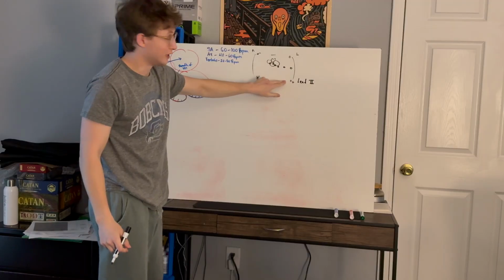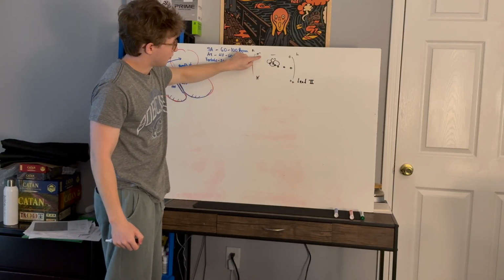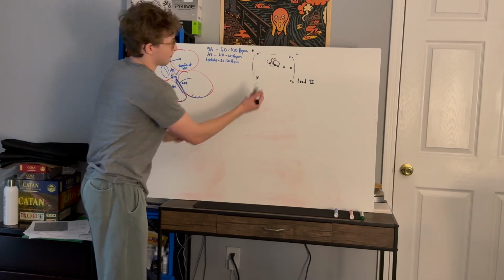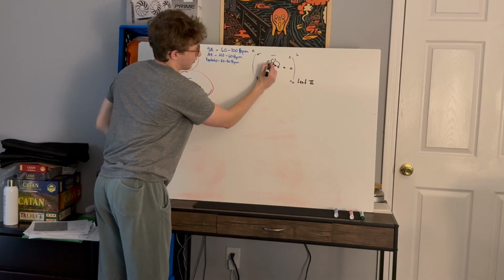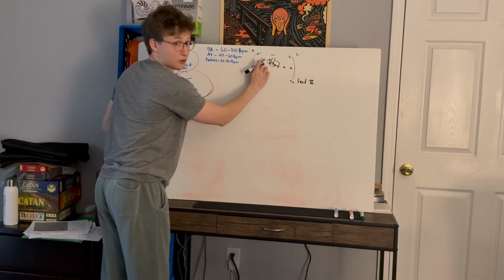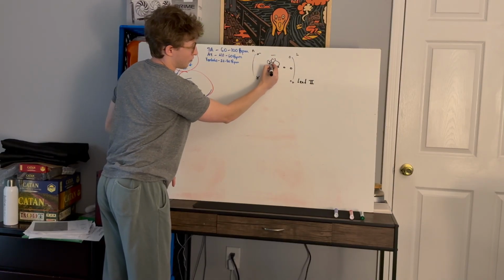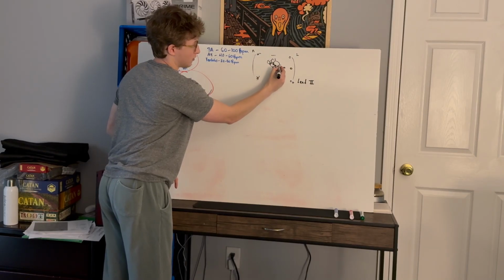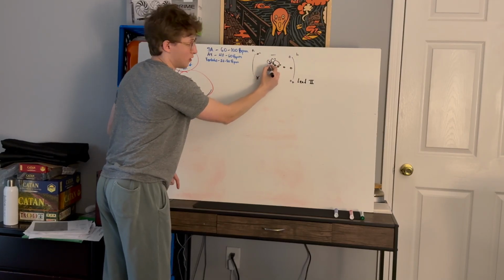Lead 2 is the most often used because you get this incredible view of the SA node up here, firing, sending signals through the atria, causing them to contract, getting to the AV node right here. That is then sending signals down and around, and then back up towards the top of the ventricles, right?